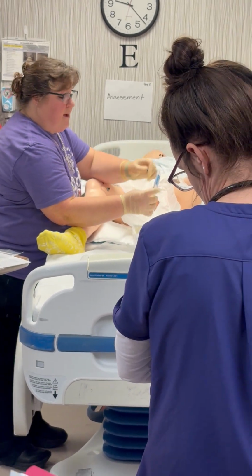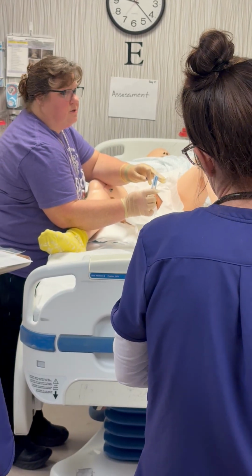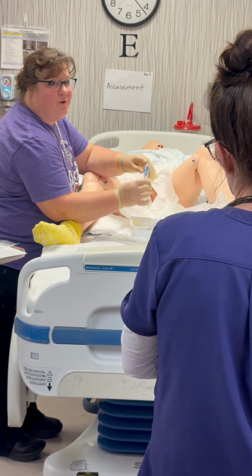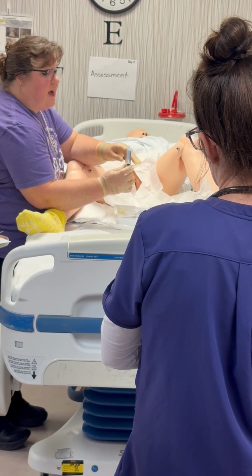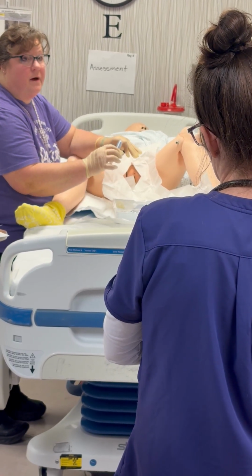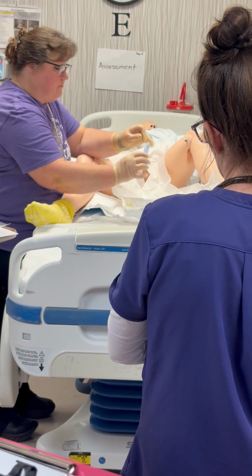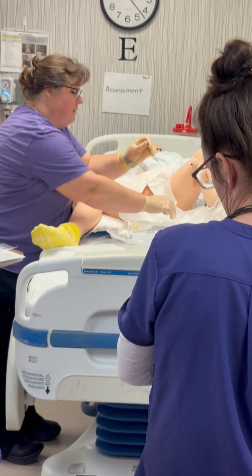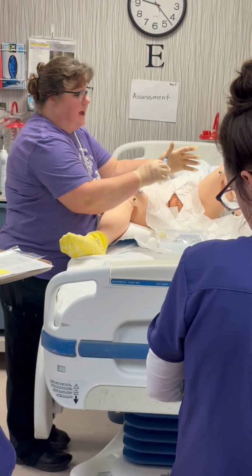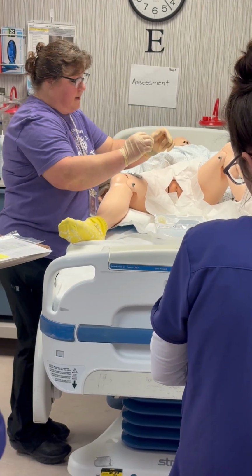So when I put my lube on, I'm just going to put a drop in here, because we don't need a bunch on this when we're practicing for these mannequins. If I was to use this in real life, I would just put the whole thing on there, okay? Because it won't hurt anything, okay? But for LRC, just put a daub in the tray here, okay? Out and around, drop it, okay?